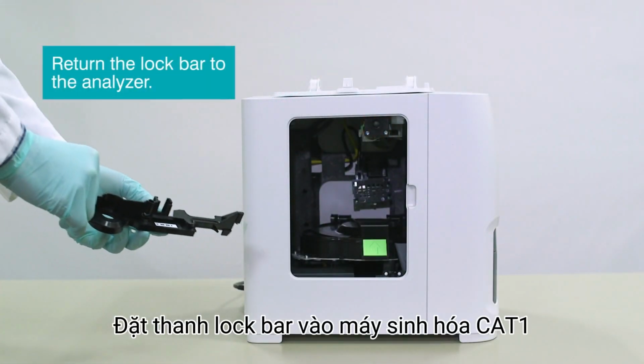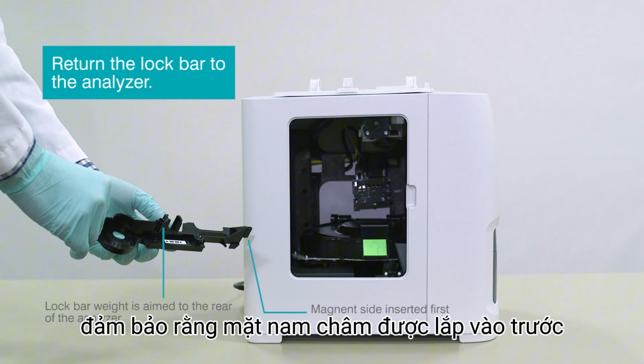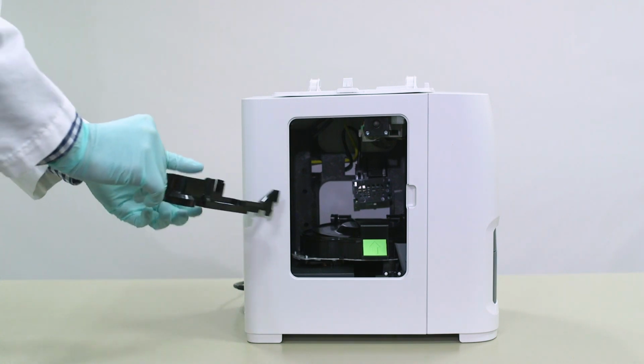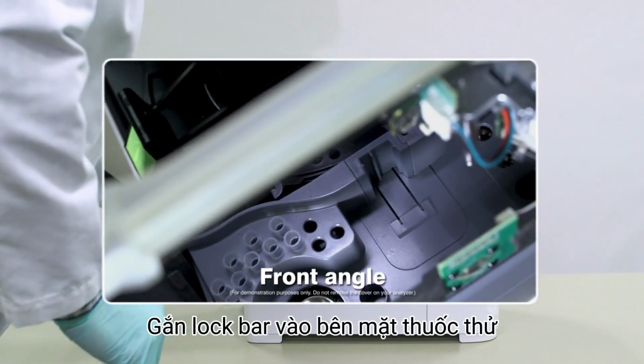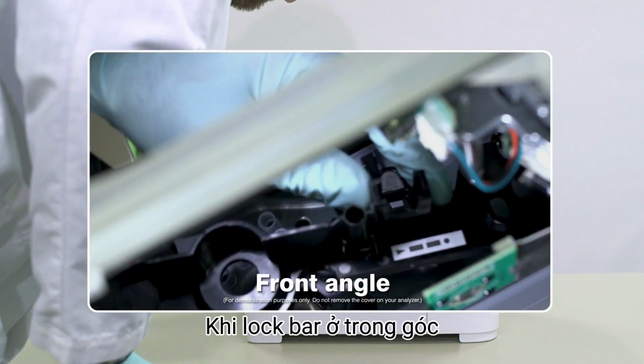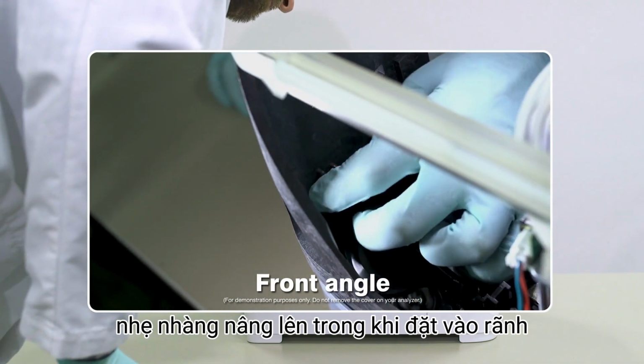Return the lock bar to the Catalyst 1 analyzer at an angle, making sure that the magnet side is inserted first and the lock bar weight is aimed to the rear of the analyzer. Insert the lock bar with the reagent side going into the reagent side corner. Once the lock bar is in the corner, hold the top of the lock bar on the tip side. Gently lift up while seating it into the groove.